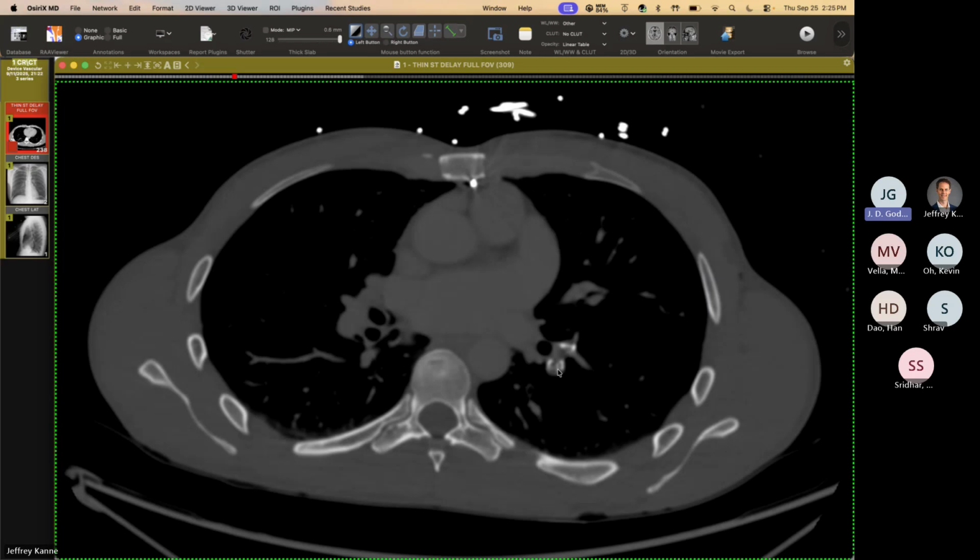Well, in this article that I think came from here, I think Greg Kitchka reported this about maybe 3 years ago or so. It was embolic. And we had before and after removal of the catheter, this thing appeared when the catheter was removed. It wasn't there before, and it had embolized. So I think this is the same phenomenon, but instead of being related to a catheter, it's related to a lead. Yeah, it's still a foreign body.